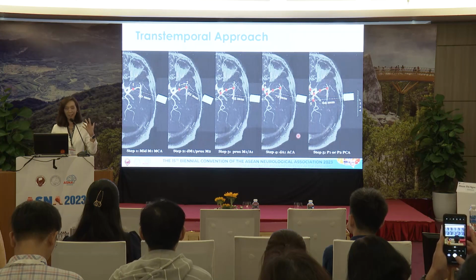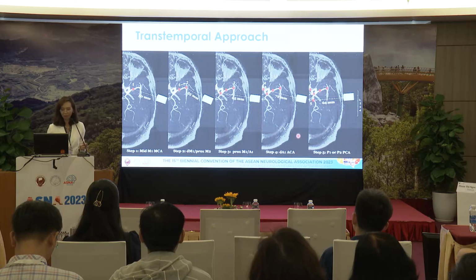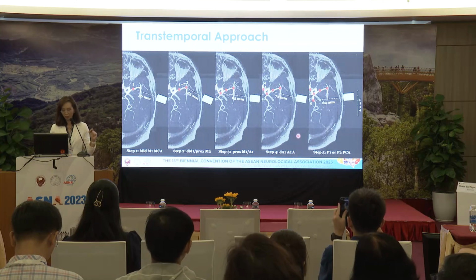So this is, as I said, blind. You can't see the picture. You just have to imagine the anatomy by yourself. So this is what we usually do. Find the arteries like this.